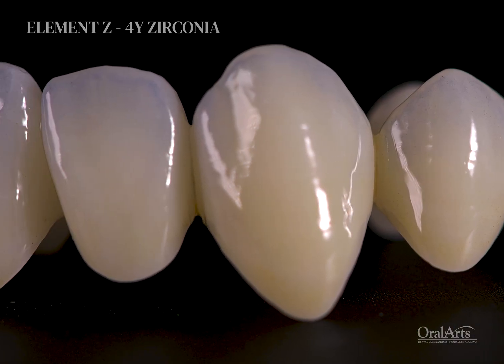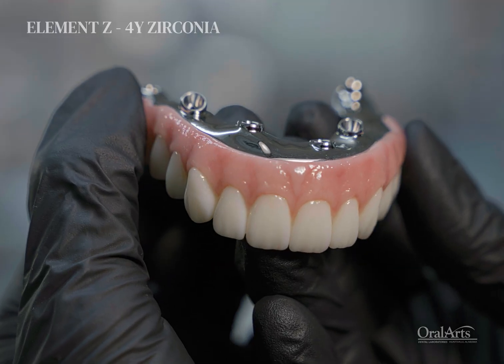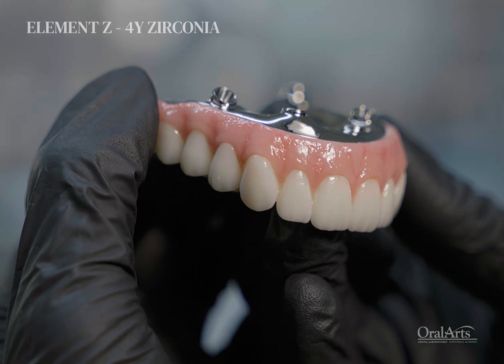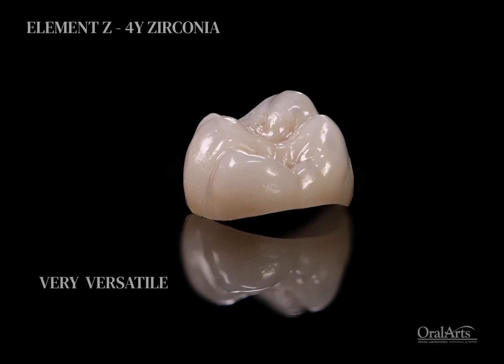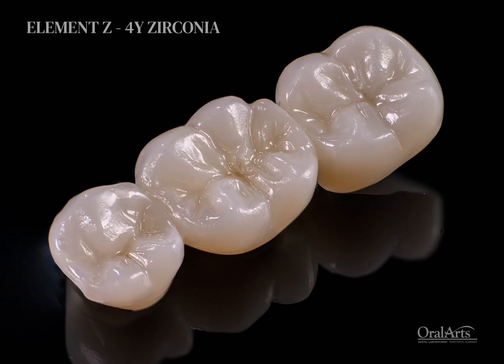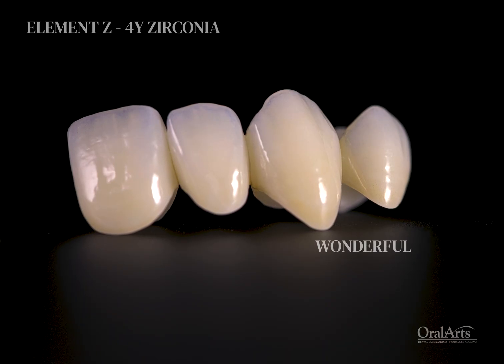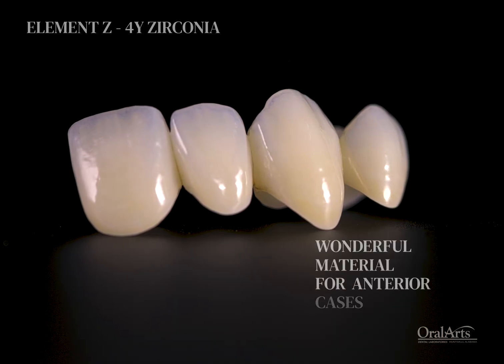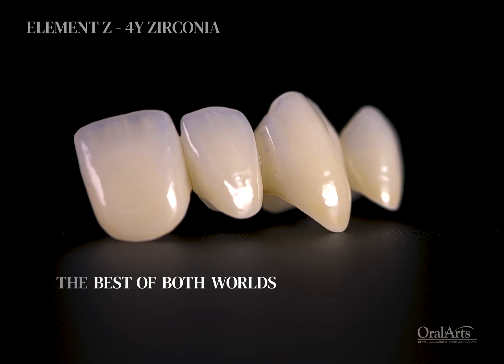The biggest drawback for the dentist associated with 3Y Zirconia is the opacity. 4Y is exceptional because it allows us to do more with it. It's very versatile — we can still utilize it in the posterior region with an amount of translucency comparable to natural dentition, but it's also a wonderful material option for the anterior. 4Y Zirconia gives you the best of both worlds.